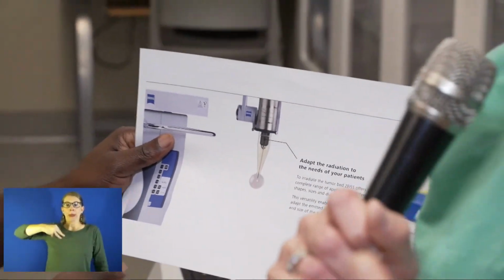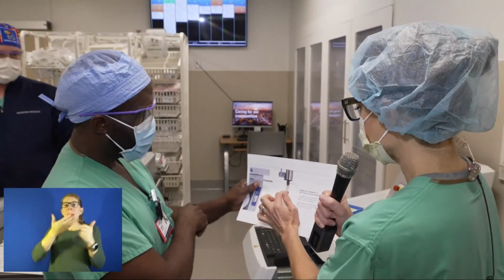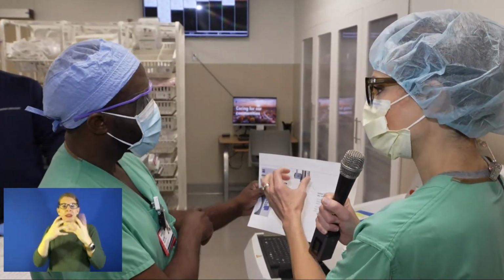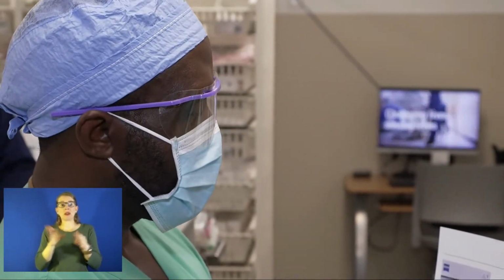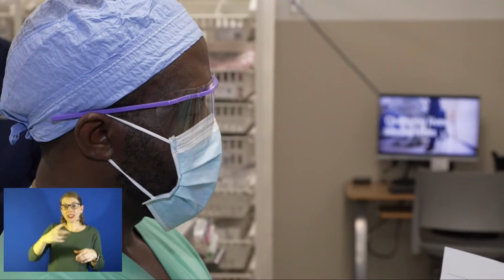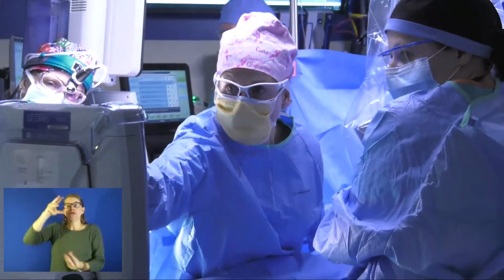So Dr. Kelsey Larson, who is the surgeon, has a whole bunch of these pieces, and the applicators are all different sizes. She removes the cancer and then figures out which applicator, which is like a ball on the end of this tip here, best fits in the cavity, and then that's how you deliver the radiation? Yes, these applicators range in size from 1.5 centimeters in diameter to 5 centimeters in diameter in steps of half a centimeter. So we have a total of about 8 of these applicators. Once the cavity size has been determined, we pick the applicator that fits that cavity size, mount it on the system, insert it in the cavity, and treat.